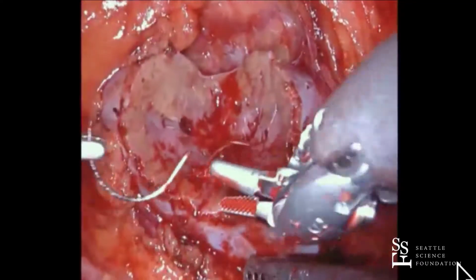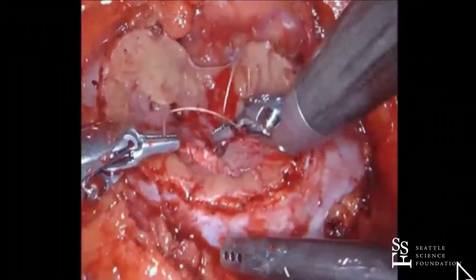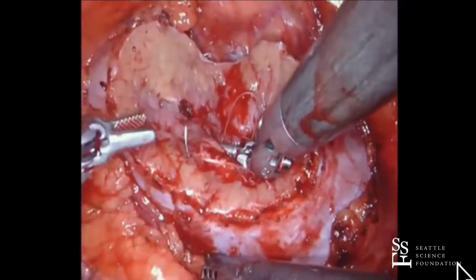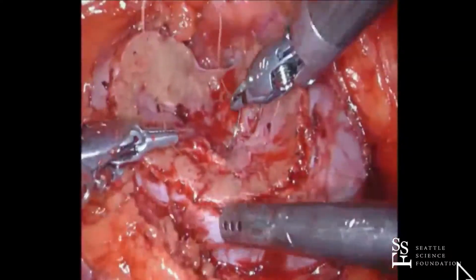I like the suture cut for that. I learned how to use it on the prostates, and then because I thought it would help me a lot on the partials, because I just didn't like bringing scissors in. As well as, got a little vessel here.